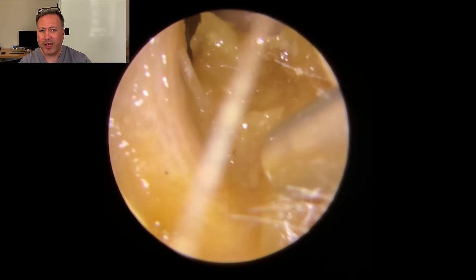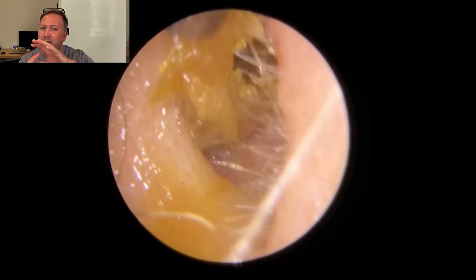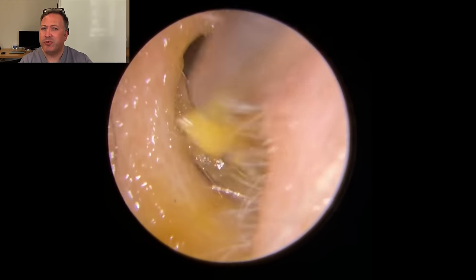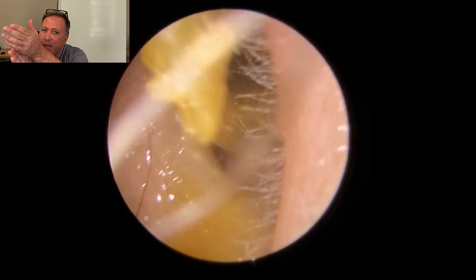This is the patient's second ear. So you'll see we've got a similar story on this side. This kind of very wet skin and wax debris here at the entrance to the canal. Still attached up to the left-hand side.